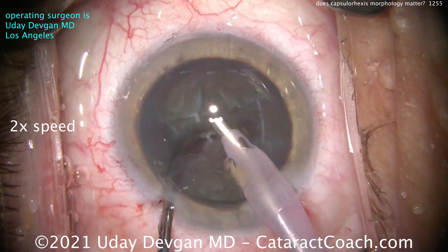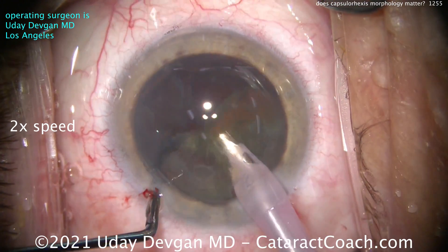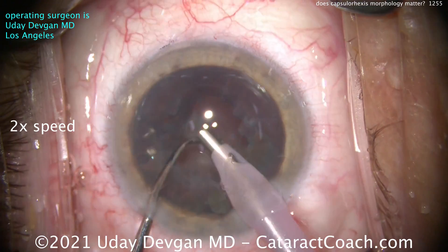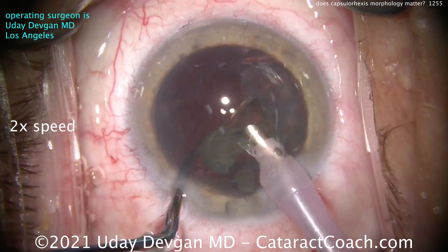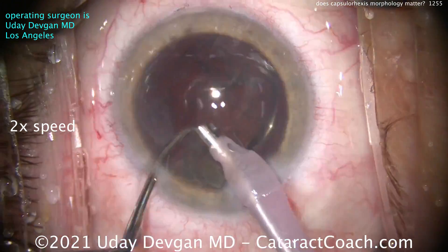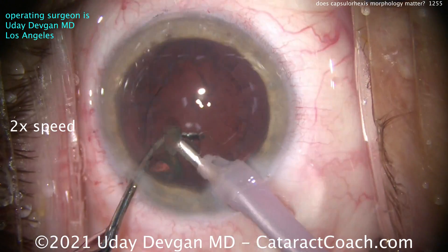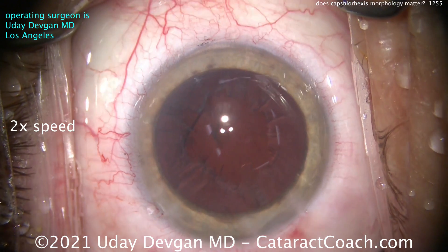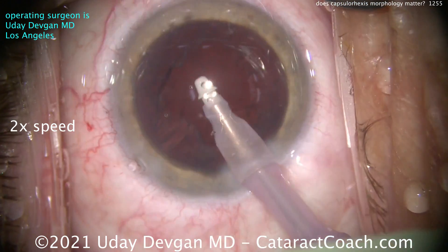I just want to show you not every case is textbook — sometimes you have to spend the energy and effort to take the case as it comes. That's the beauty of this surgery: every case is actually a little bit different, no two are exactly alike. The nucleus comes out pretty easily. We've got the video going at two times normal speed just so we can get to the good part, and that is going back to that rhexis.